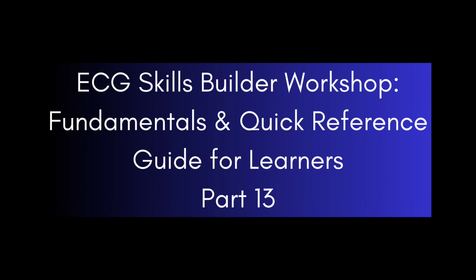Welcome back to my ECG Skills Builder Workshop, where I will be covering all of the fundamental knowledge and skills you will need to read and interpret an ECG in a quick and effective manner. This will be part 13 of my multi-part video series of doing so. Today we will be looking at various types of heart blocks and how they can be interpreted on an ECG. Without any further delay, let's go ahead and get started on today's content.